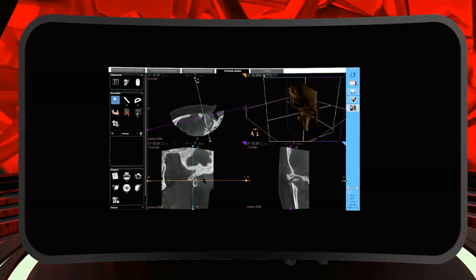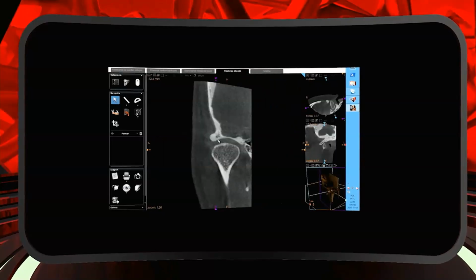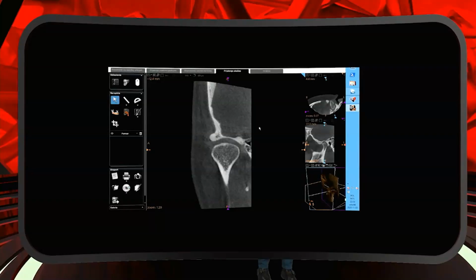And we do that. And what you see now in the right lower corner is that we already have the coronal projection. And you see beautiful condyle in here. You see the cortical bone of the condyle. You see the joint space that you can measure. So you can take a ruler and you can measure the space if this is enough for the disc. Maybe it's too narrow, maybe it's too wide, maybe there's destruction, maybe there's compression. It looks fine. For me, it looks fine. Then you can also calibrate it in the midline of the condyle.